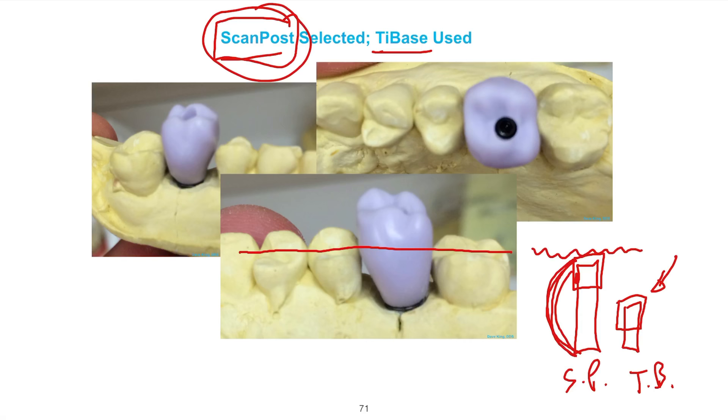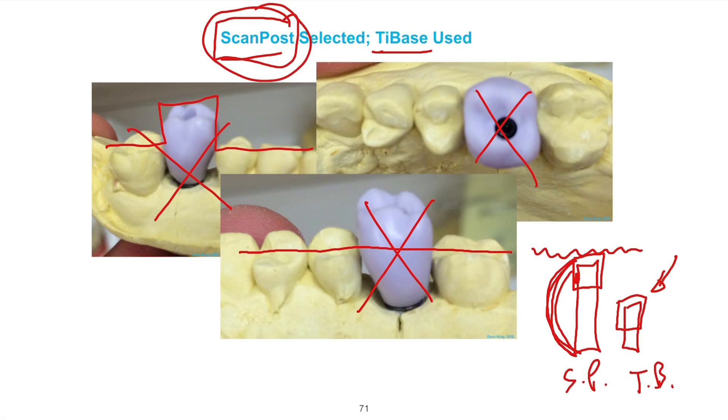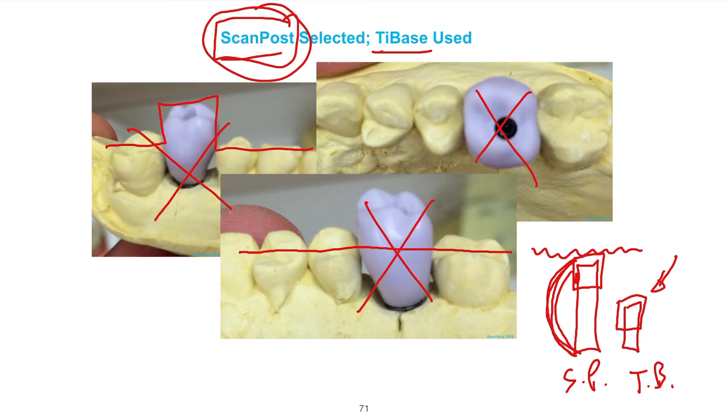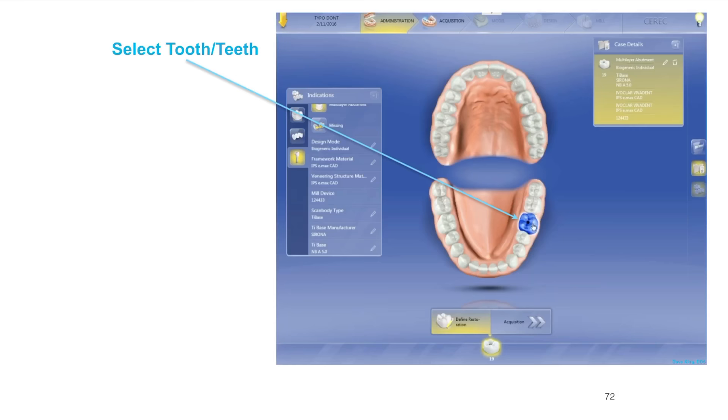If you put in a tie base and you have the computer selected at scan post, this is what you get. That doesn't work. That's not going to work. You'd have a heck of a fun time doing occlusal adjustment to get that to work. Make sure that you select what you use. Select scan post, use a scan post. Select tie base, use a tie base. You can go back if you realize you've selected incorrectly, but you'll have to re-image because you cannot switch between the two without re-imaging.